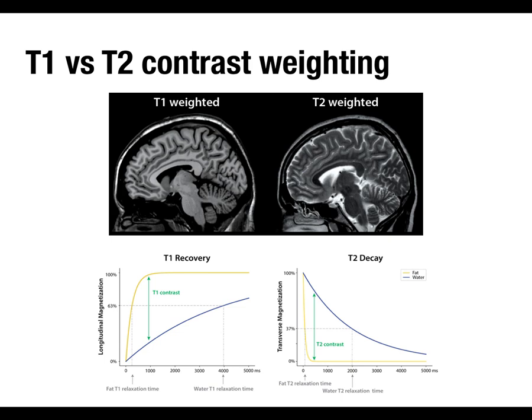T1 and T2 are the simplest and most illustrative for talking about MRI physics. But in typical clinical protocols, they'll do a number of different scans with different kinds of contrast weighting that are typically done around the particular diagnosis they're looking for, the different things they think might be wrong with the person. All right, so that gives you your T1 and your T2 weighted images.